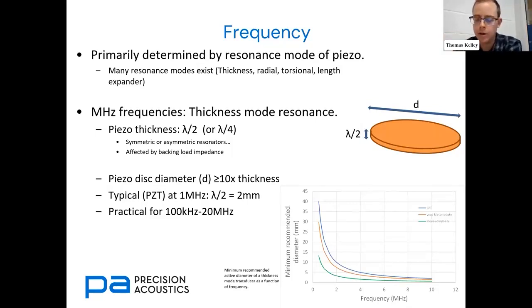So we were looking there at the film thickness of 9 microns. If you consider that in the order of the parallel plate capacitor, you have an incredibly high capacitance, and it's in your circuit. It's inherent. You can compensate for it, but you can't take it out, and it weighs very heavily on the frequency of the transducer that you build with the film.